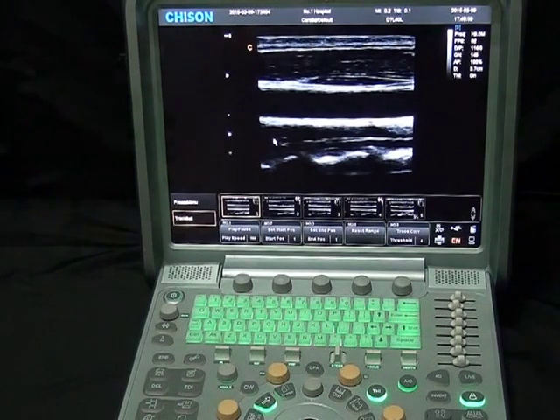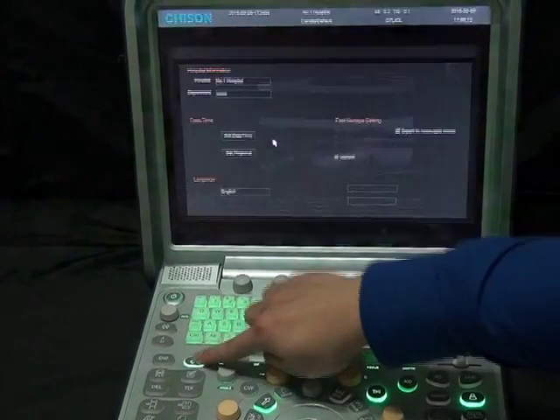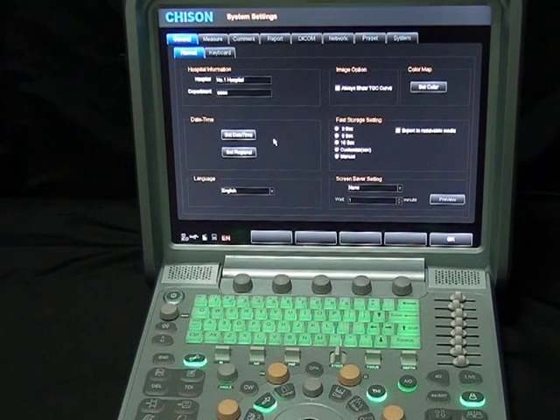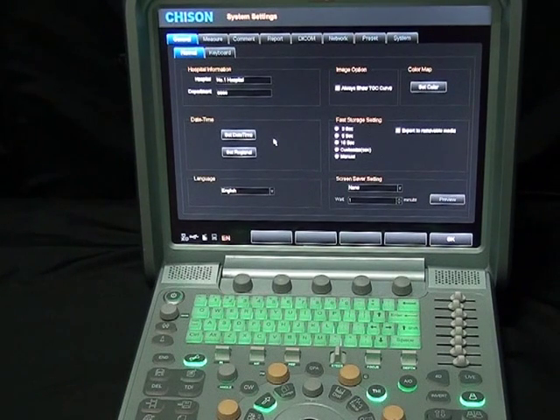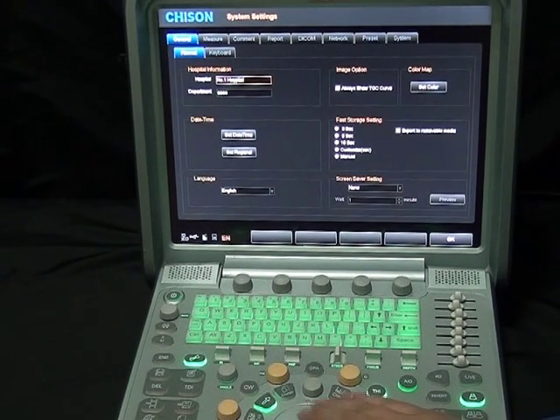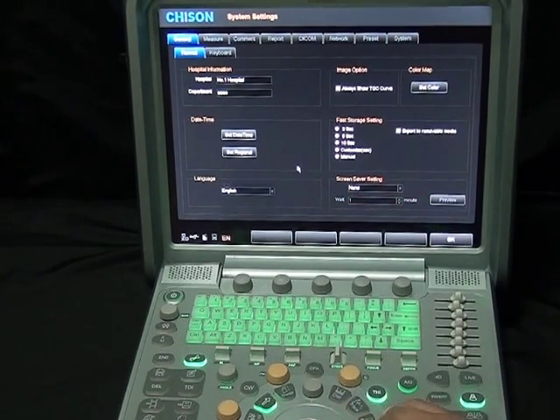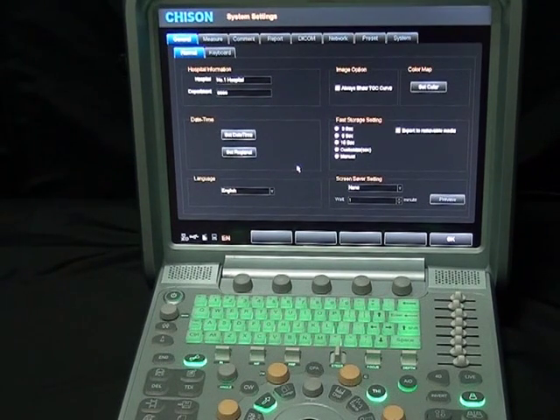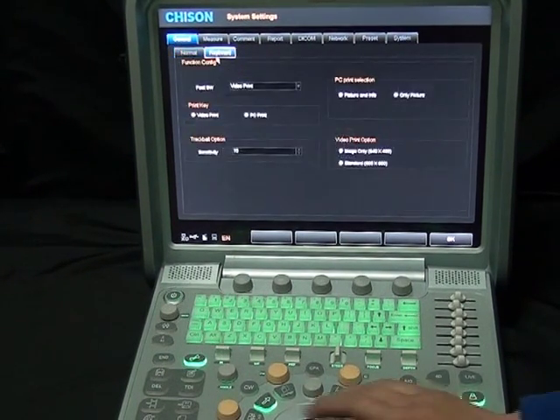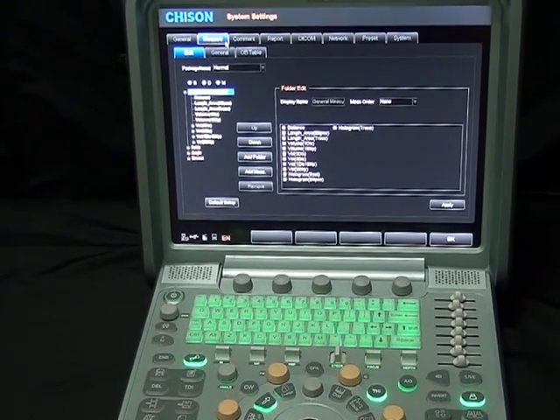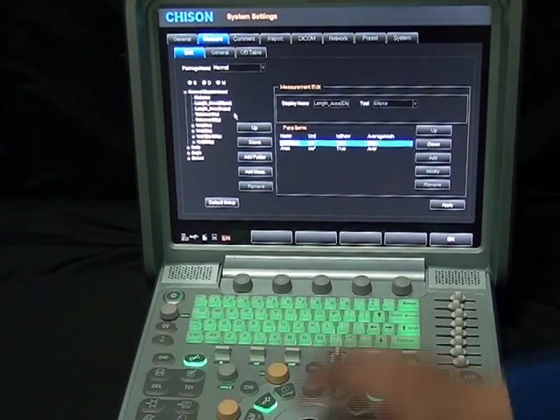Part 5: System setting. After the entire workflow, let me show you something about system settings. In the system setting interface, several items are available to make your operation more streamlined and user-friendly. In general setting, we can set hospital name, date, and time. We can also change language without restarting. The foot switch can be used as a hotkey for shortcuts. In management, user-defined options are available — we can add measurements and formulas for each probe, each preset, and each mode without limit.